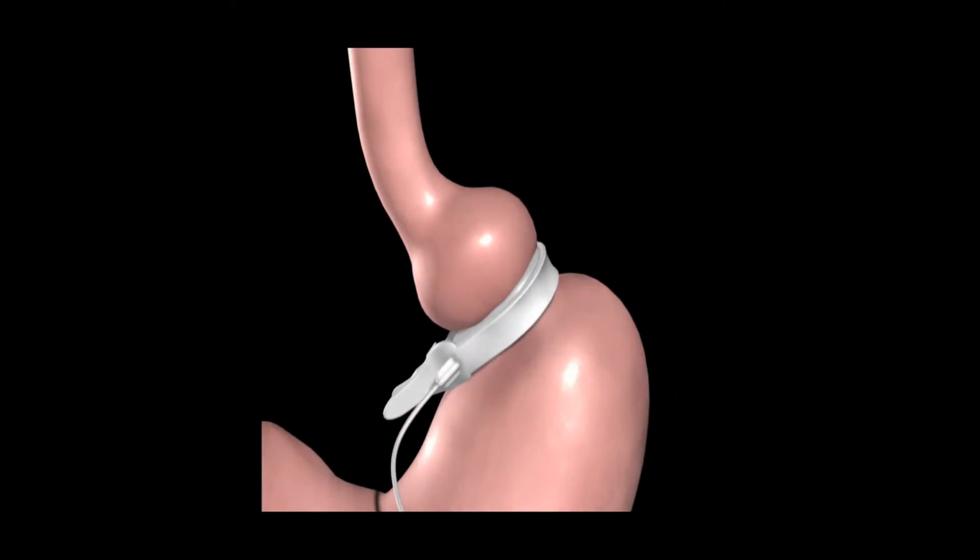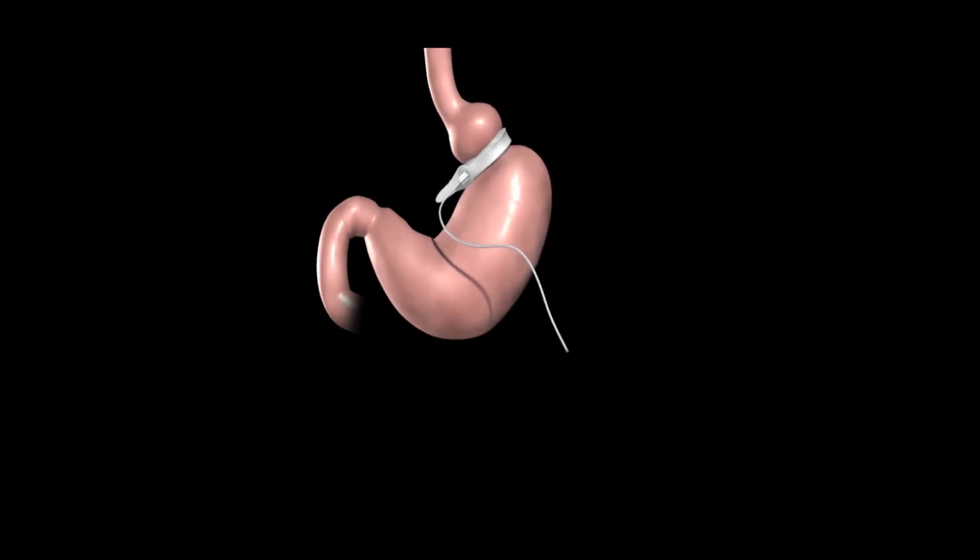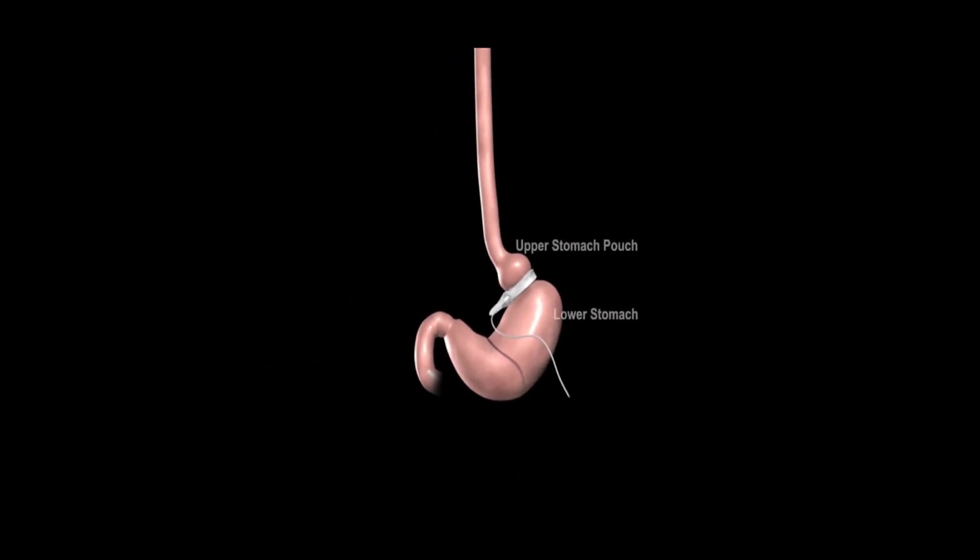A tube attached to the Realize band will be connected to the injection port. The port is used to adjust the band tightness after surgery. An incision is made on the upper abdomen to insert the Realize injection port beneath the skin. The tube is secured using the locking connector on the port. The injection port and tube are placed beneath the skin.